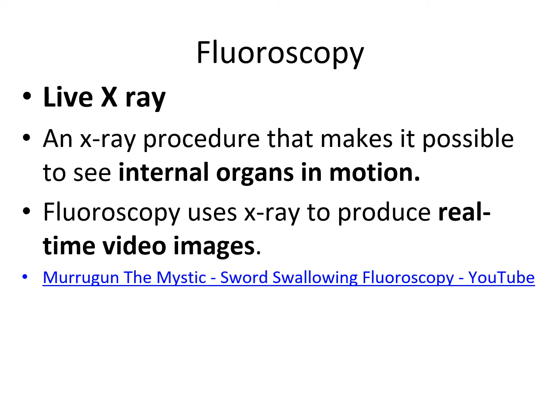So you can watch this cool little video clip. It's just basically showing this guy on live fluoro swallowing a sword. It's pretty crazy. So another time that you'll see it is like when I was saying in the ER, they will use it when you're resetting.